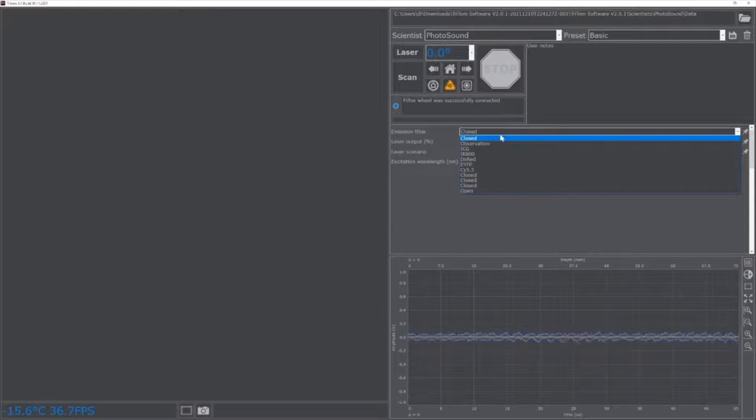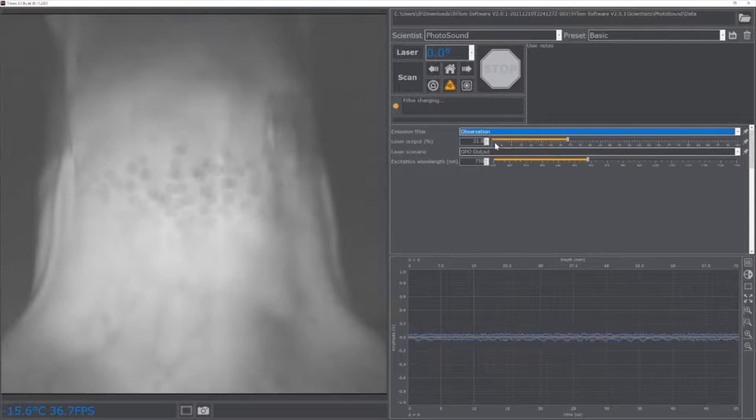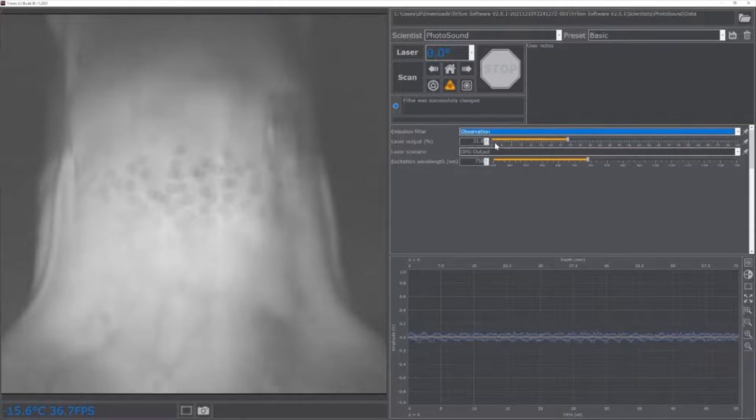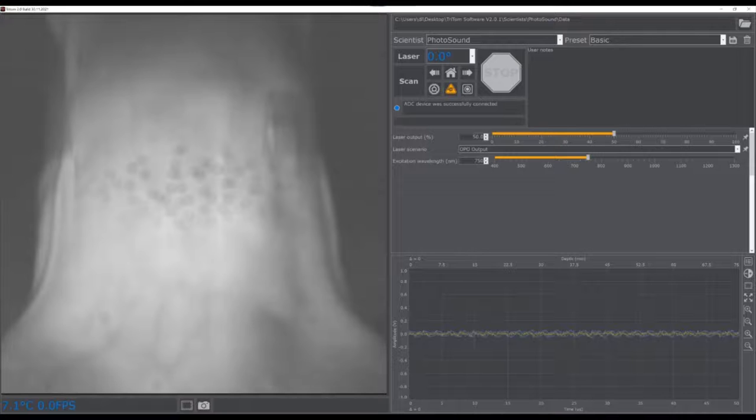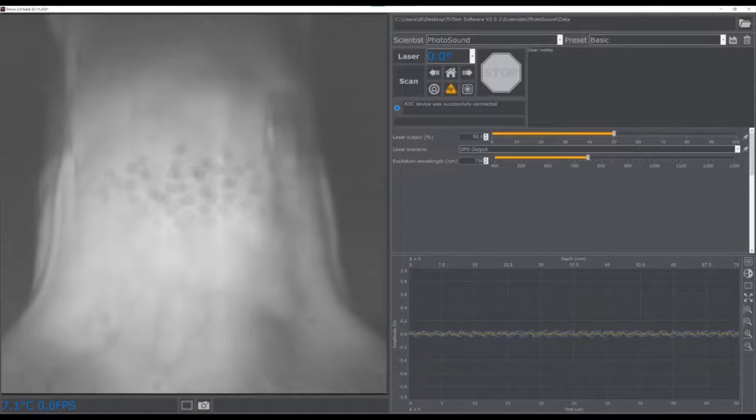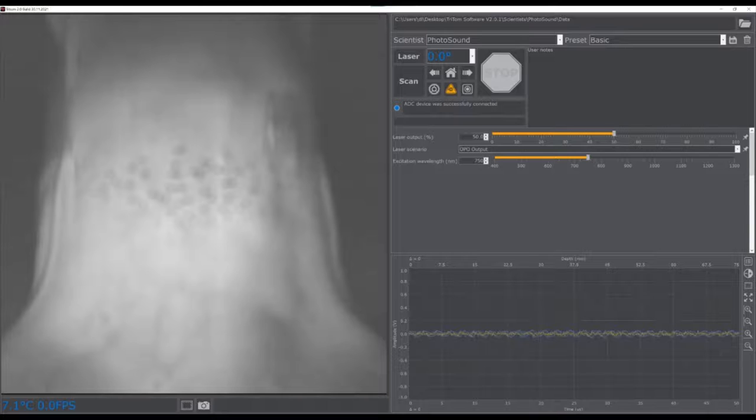To enable the camera view of the imaging chamber, open the laser settings menu and select the appropriate optical emission filter from the emission filter list. The Triton standard emission filters include an observation filter for animal monitoring and a range of emission filters covering most fluorescence imaging applications.